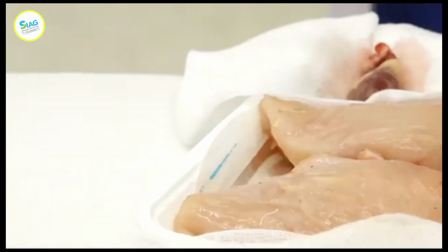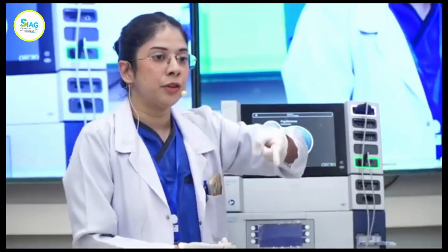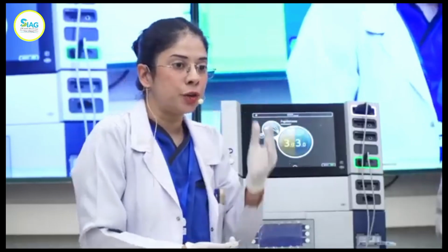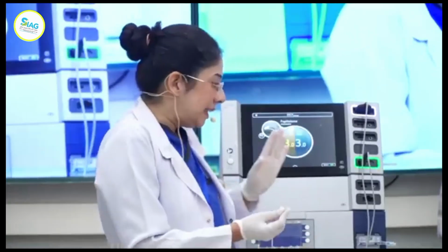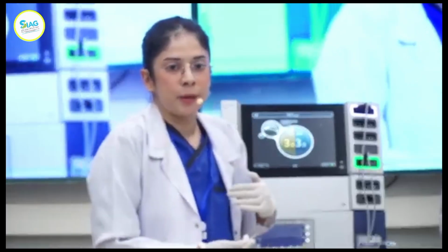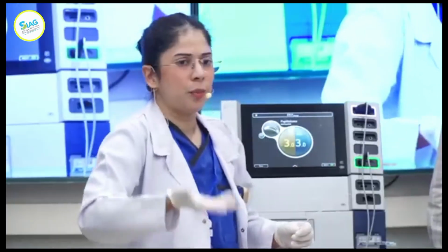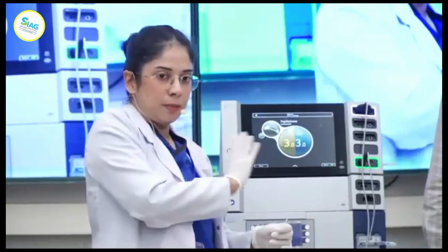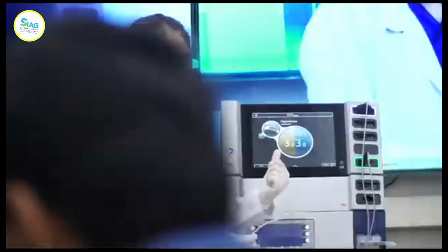Slice. So again, it's not illegal, but clearly when you're doing a sphincterotomy on a small ampulla, you don't want to, as a trainee, find yourself going all the way up and you're not in control of the speed, the axis, or the sphincterotome. So that's just my take home from my experience. Obviously, there might be some trainees who do pure cut on the first go, but that really depends on you. Again, it's not illegal to use spray cog.